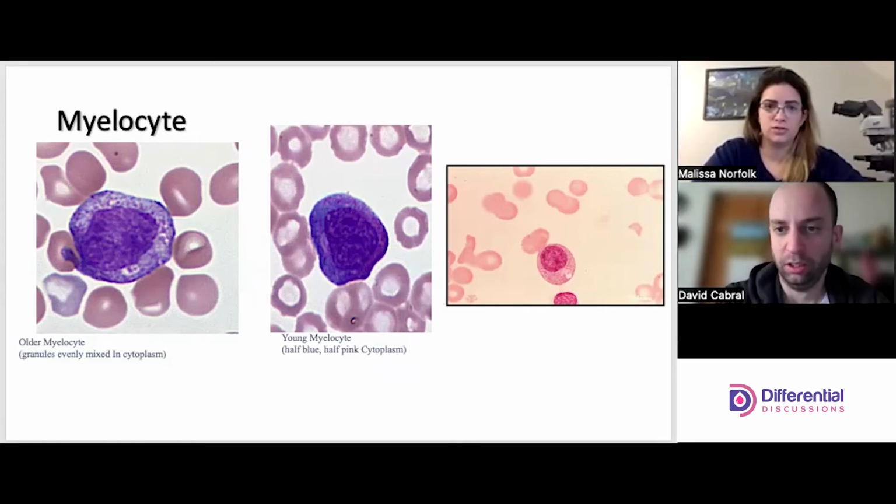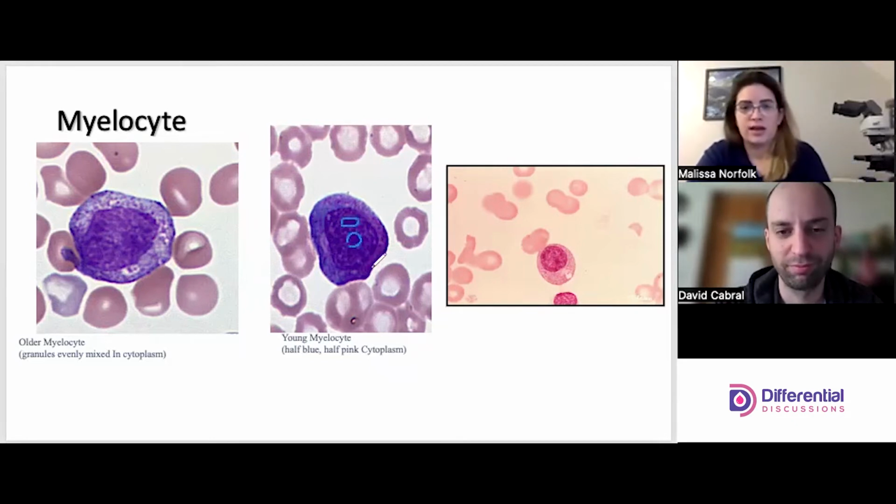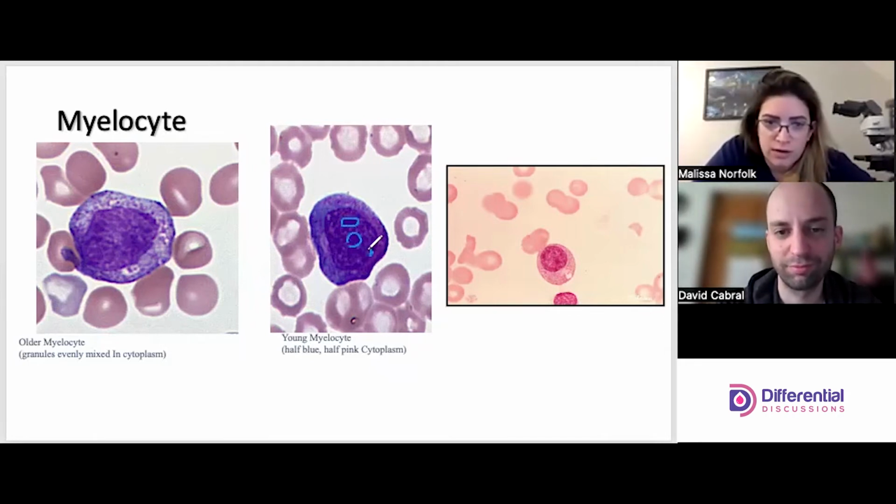And let's just draw. So you can see right here, there's a deep dark spot, right? And then here there's another deep dark spot. And then there's a few little deep dark spots over here. There's a little one over here. But now you're mostly seeing light purple and white lines through the light purple.